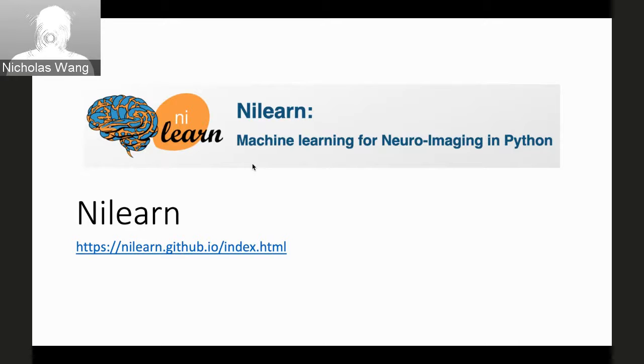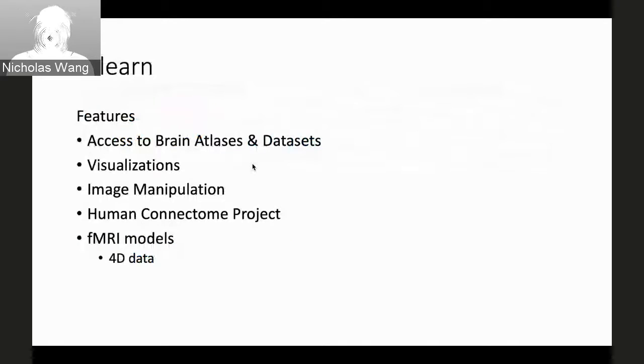But for the next, I'd like to talk about NILearn, which is a nice set of neuroimaging packages beyond the kind of utility functions that NIBabel provides, which also come with a nice, what I found very helpful in these visualization tools and also other machine learning tools that are included. There's a lot of great documentation for this package. There is some good documentation for NIBabel as well, but it's less fully coded out in the way that NILearn is.